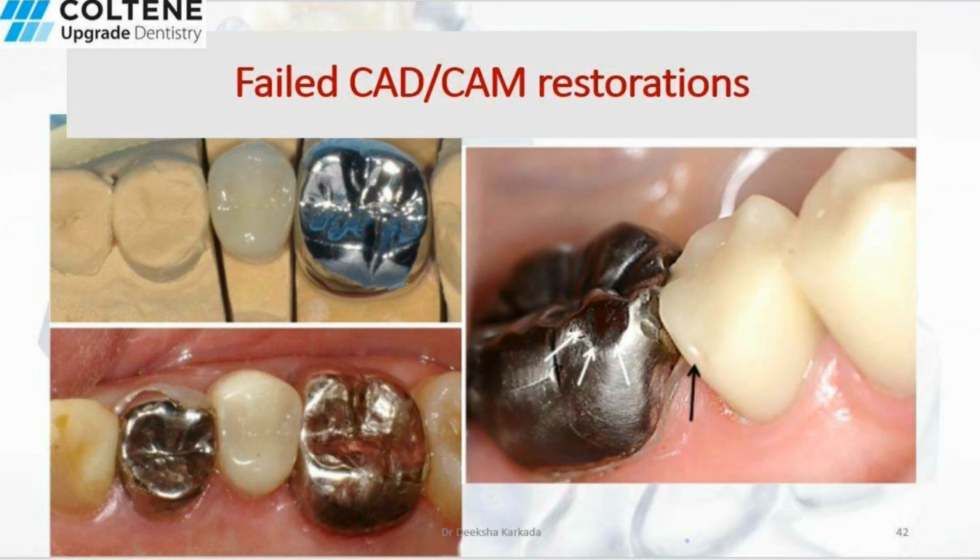These two images are the clinical photographs of a resin composite CAD-CAM crown for the restoration of a premolar tooth. On the third image, the black arrow shows the chipping that occurred 1 year post cementation on the distobuccal surface, which was fabricated by Cerasmart GC, and the white arrow shows the abrasive trace affecting the mesobuccal surface of the metal crown seated on the first mandibular molar, signifying a concentration of occlusal force in this region.